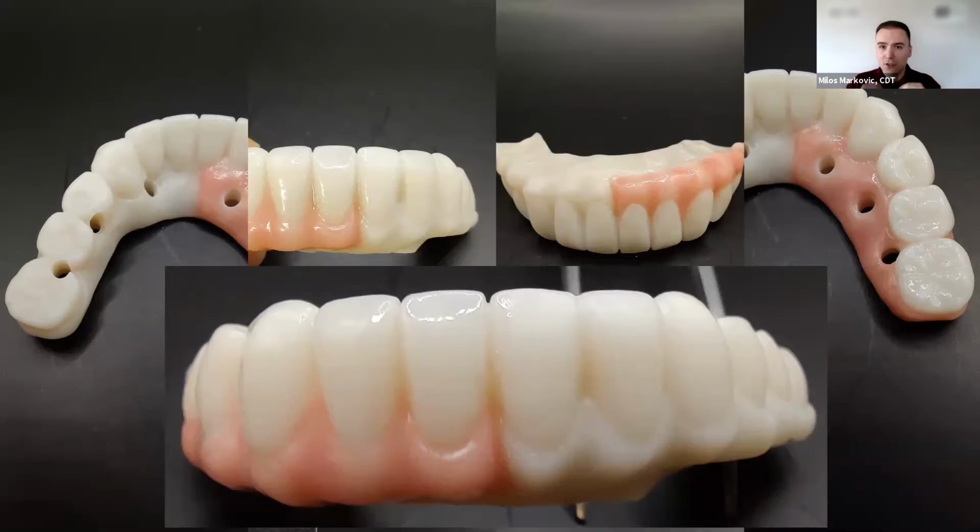It just pops. It just comes to life. So that's the benefit of layering pink gingival porcelain. And as you can see, the zirconia itself also comes to life. So I thought those were very interesting to show, to show the contrast between the two.